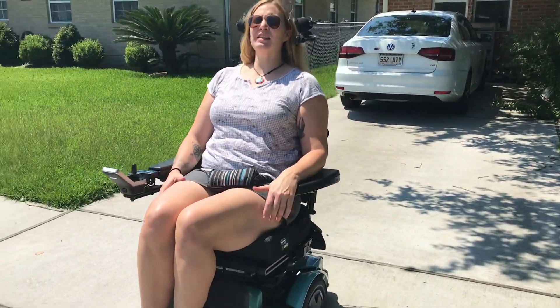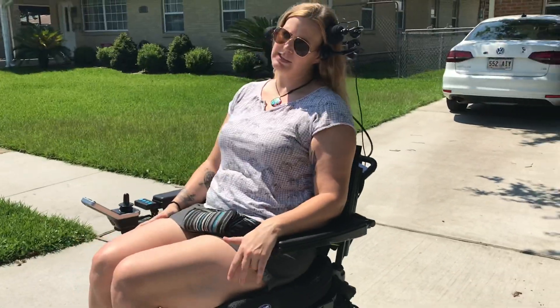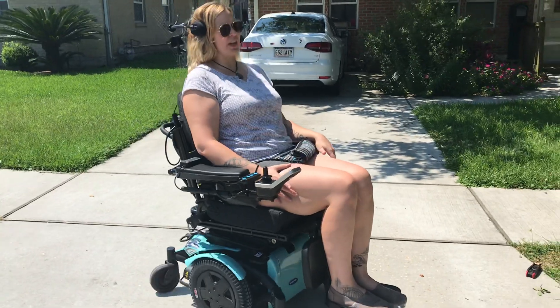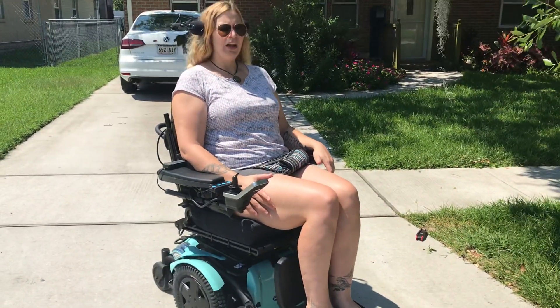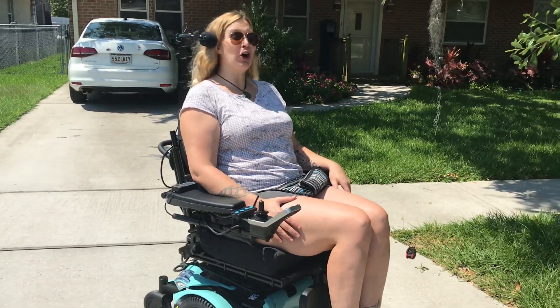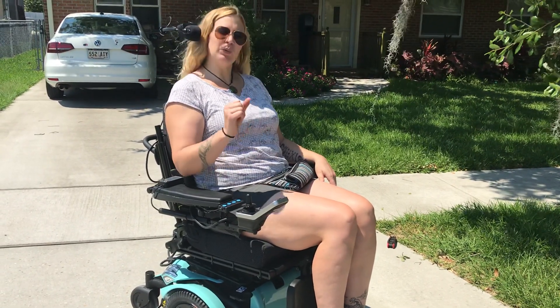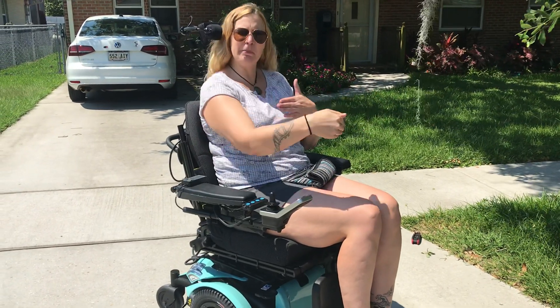What it is is a head array to control movement of the chair. You can see there are pads to turn on either side, and I can also use my head to go forwards. With this control, it's proportional because if I push my head harder on one of these pads, I will go faster — similar to a joystick where the further you push it, the faster you go. Kind of pedal to the metal.